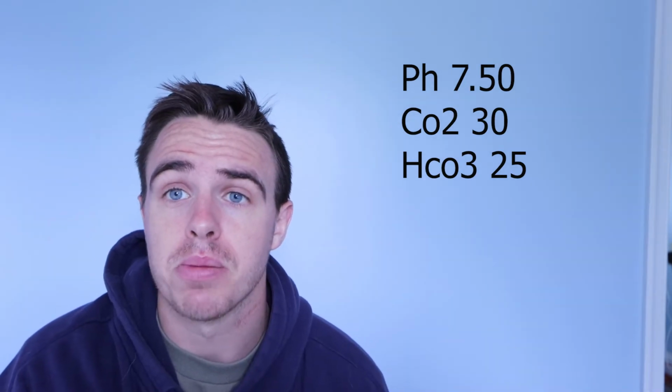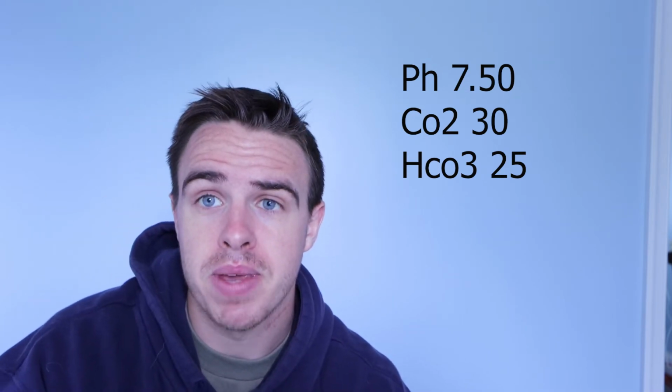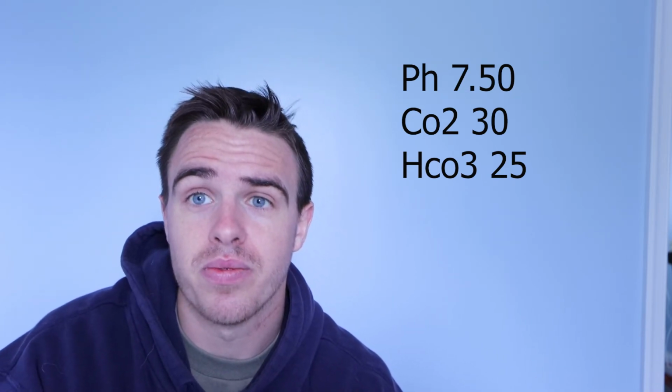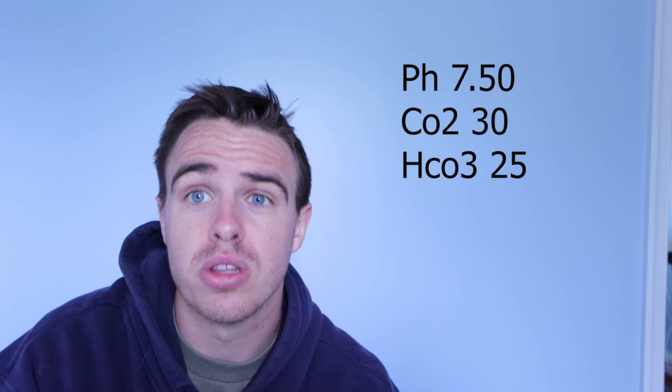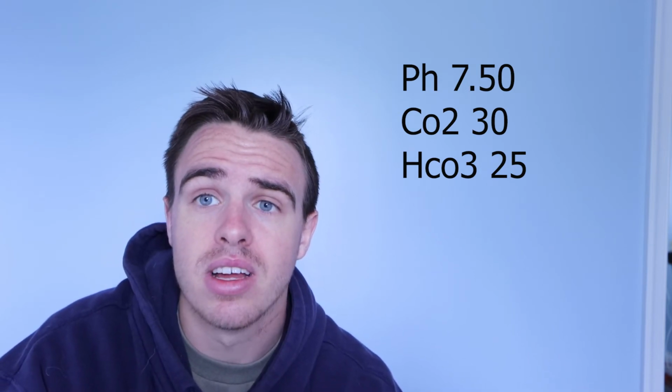So once again, let's look at the pH first. Okay, not normal. Let's look at the CO2. It looks out of whack. Okay. Let's look at the bicarb next. Okay, that's normal range. So the two things that are out of whack here are the pH and the CO2. So what is the CO2 doing to the pH? So we can see that the CO2 is on the lower end, which is going to bring the pH up. So we have less acid, it's going to bring the pH up, make it more alkalytic.